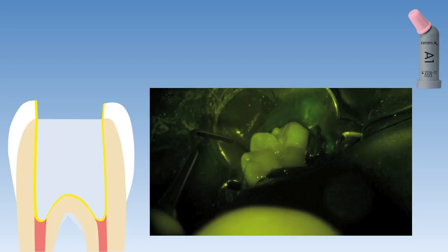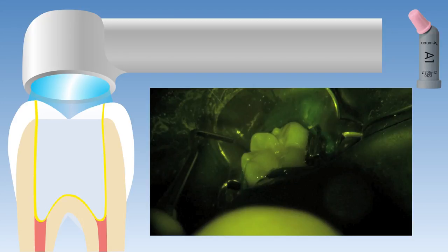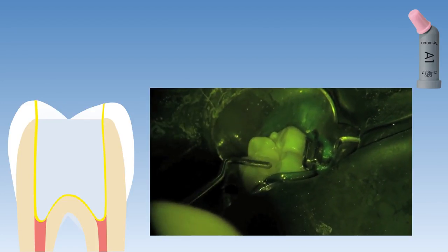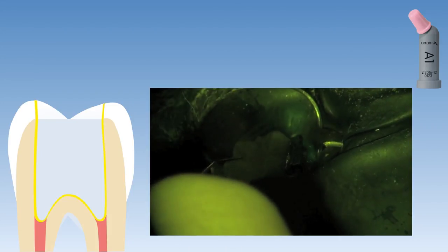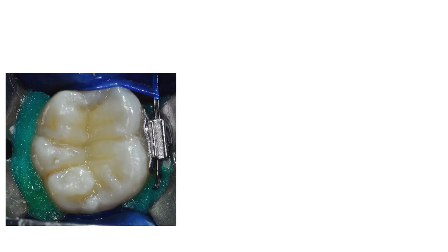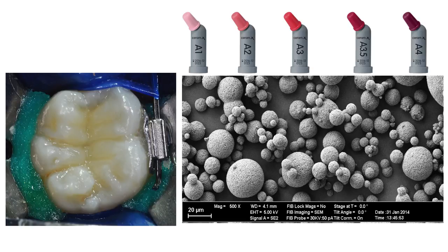The last step for restoration of this access cavity is to cover the SDR material with a normal regular viscosity composite resin. The SDR material was capped by applying Ceram.x Spectra ST composite resin, shade A1, using the successive cusp build-up technique. The new Ceram.x Spectra ST material contains primary glass fillers with a mean size of 0.6 microns to create granulates with a mean size of 15 microns. These granulates are produced in a spray drying process resulting in nicely rounded spheres — this innovative filler technology, Spectra ST, improves the mechanical strength and handling properties of this material.